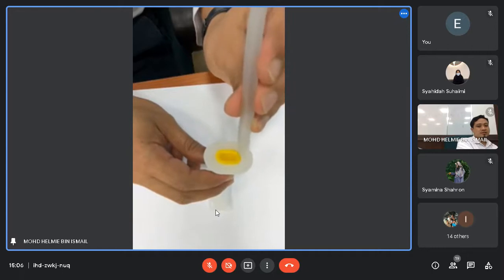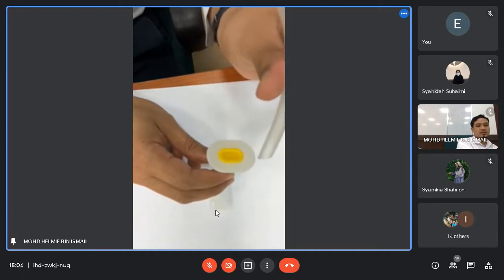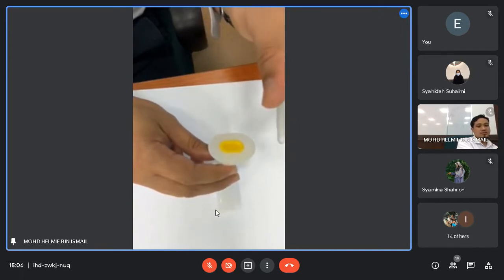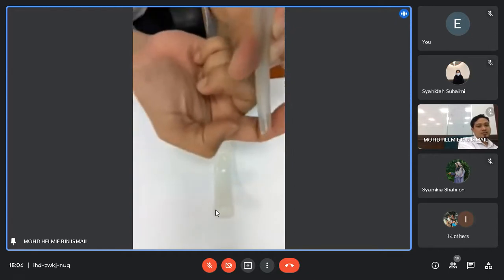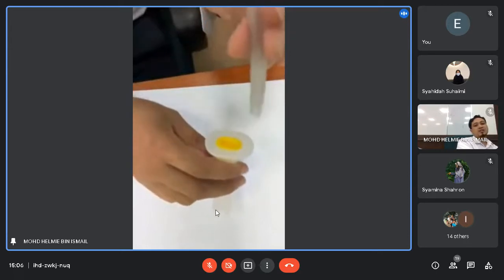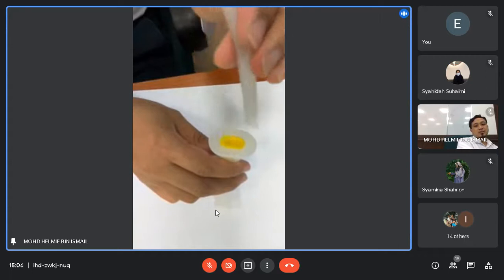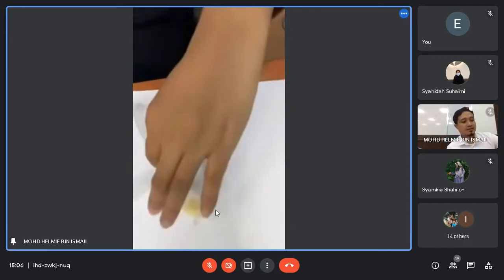On the other side, you rotate, making sure the bevel is at the medial part and this one is the lateral part. Then you insert, rotate 90 degrees anti-clockwise and then clockwise, until inserted. Alright, that's it, easy.